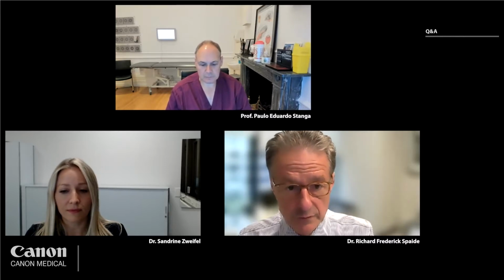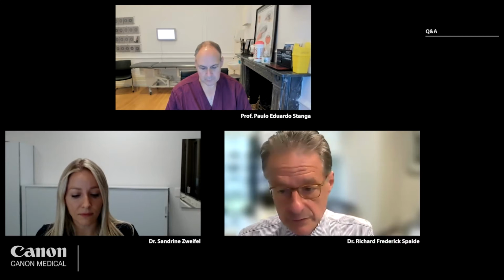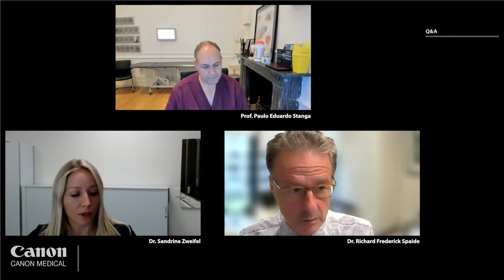Rick, you start. The images are sometimes a little bit noisy with the OCT, and also the resolution is a little bit less than for the OCT that you're used to, I think because the scan pattern is a little bit looser, especially for the bigger ones. So I think that AI denoising is very helpful. We were very careful about looking at that to make sure that it wasn't making up blood vessels or the like, and it doesn't seem to be like that at all. So I commonly use the AI denoising. Sandrine? Yes, same for me.